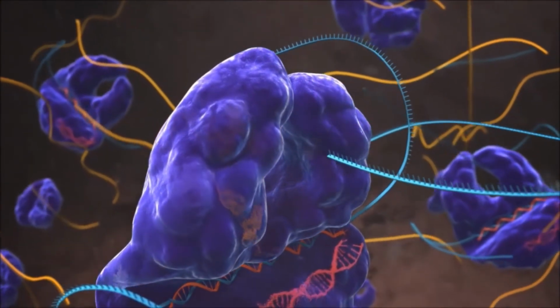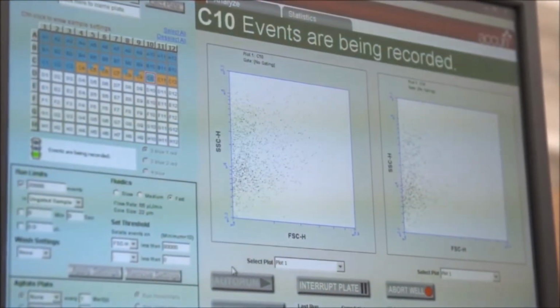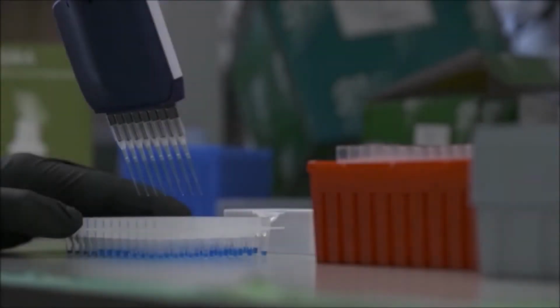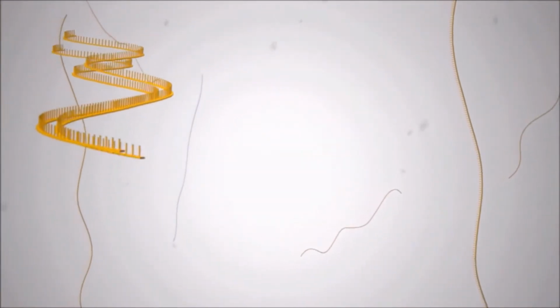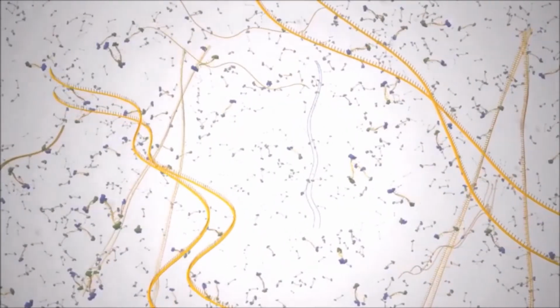It is this mechanism that scientists at the McGovern Institute, Broad Institute, and Harvard University harnessed to create Sherlock, a highly sensitive tool to detect infectious diseases in humans. Here's how the Sherlock detection system works. First, researchers take a sample from a patient with a possible viral infection, like the flu. Then, they amplify the levels of RNA in it and add reporters that are sensitive to Cas13.